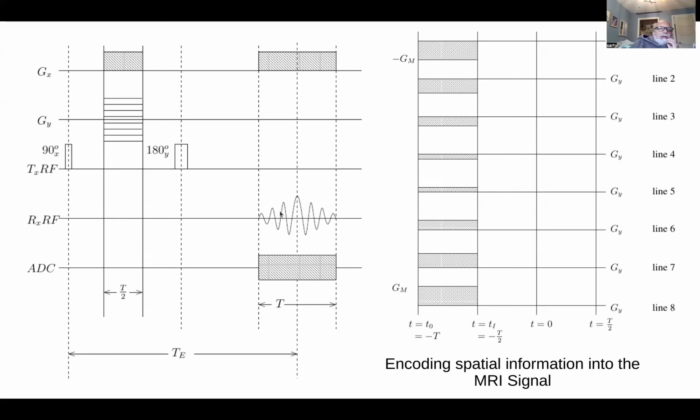Yes. Everything, when you think about things in the rotating frame, is already modulated. The Larmor frequency is modulated out of any data that you're collecting. Does that make sense?